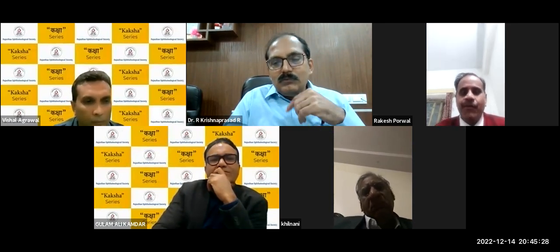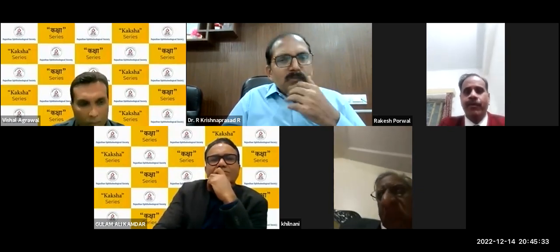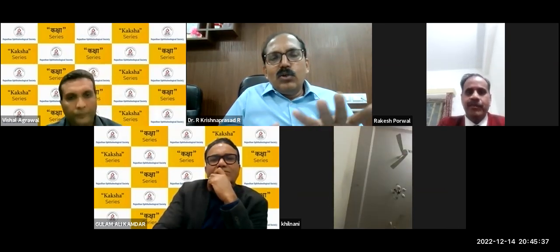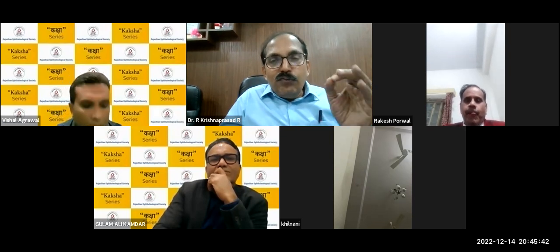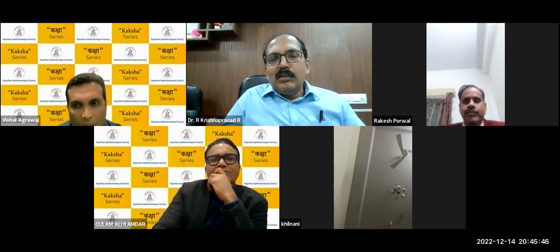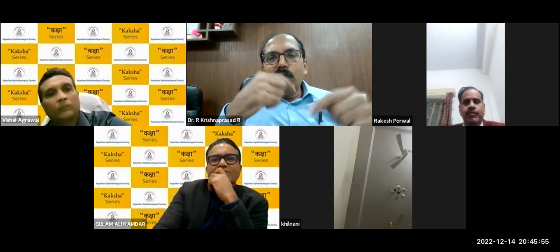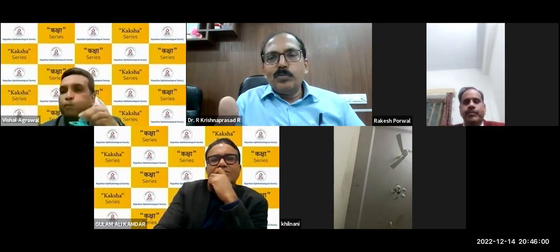Sir, second thing I want to ask you, what is the role of the phoropter in the present scenario? The phoropter is a good toy, a little costly. And if you get used to it, it is one of the fantastic things. It saves so much time. But you don't have to have a phoropter. The phoropter is basically an automation of your trial frame and glasses. If you are regularly doing subjective correction yourself, then you can buy a phoropter and get used to it.